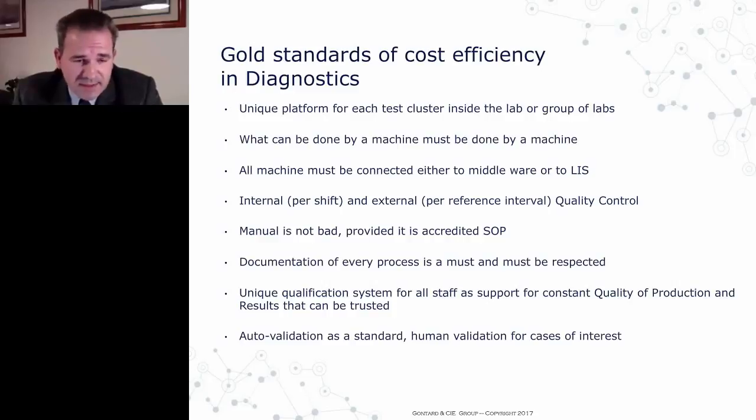In some markets it is too expensive to do it mechanically or automatically on the machines. For example, in Russia, some tests are so badly paid by the public or by the hospitals that we have to do it manually, especially in the ELISA department. And therefore accreditation is extremely important, because then quality and costs are person dependent. If you have good SOPs and a good accreditation mechanism, your costs are in check. Otherwise, you can have explosive costs, especially when you open 96-well plates and you have only four wells that are used. So you really need to look at these things very carefully.